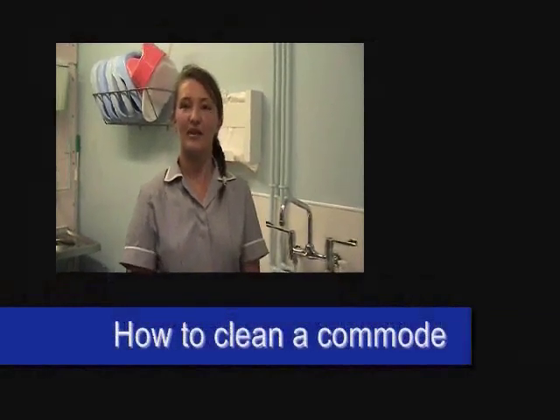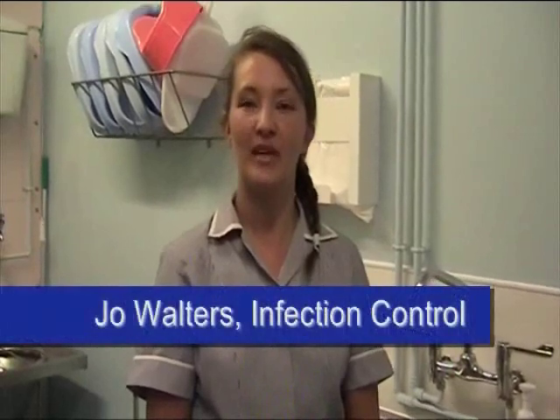Hello, my name is Jo Walters. I'm an infection prevention and control nurse and I'm going to demonstrate how to properly decontaminate a patient commode.